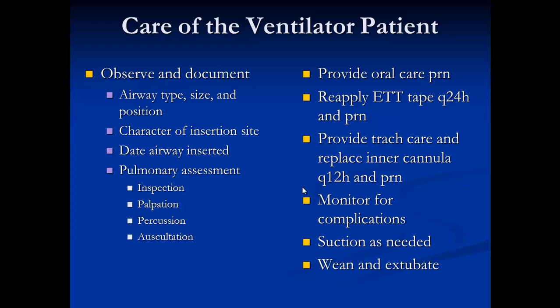Before we go to the care of the ventilator patient, what are the guidelines to initiate mechanical ventilation? Choose the ventilator mode with which you're most familiar first. So if you're more familiar with assist control, start with assist control. If it's very difficult for you to manage pressure control, don't start there. Anyways, the first initial mode is assist control. You never start in pressure control unless you have exhausted already your AC parameters.